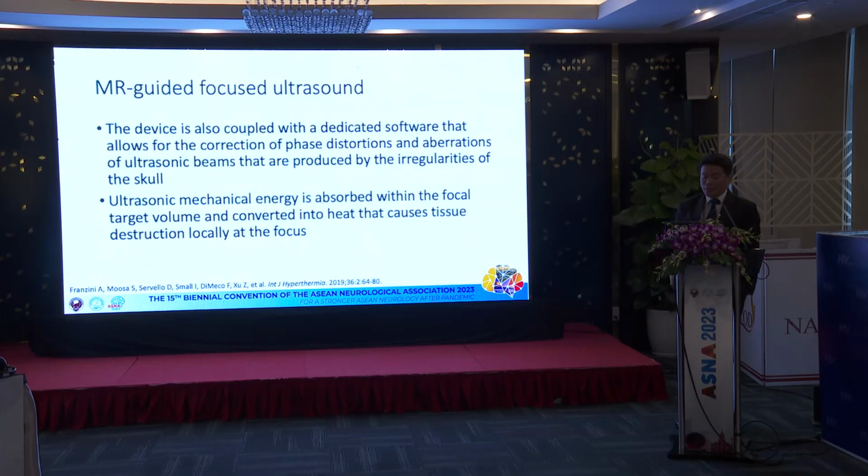So the device is also coupled with a dedicated software that allows for the correction of phase distortions, aberrations of ultrasonic beams, and the ultrasonic mechanical energy is absorbed within the focal target volume and converted into heat that causes the destruction of the tissue.